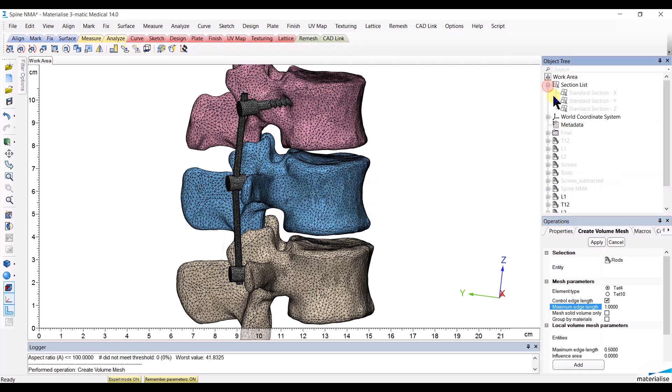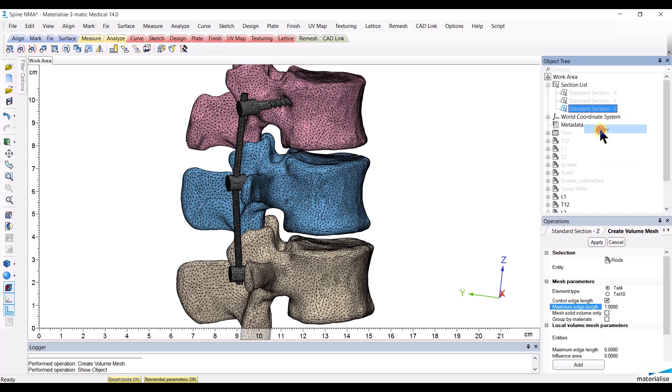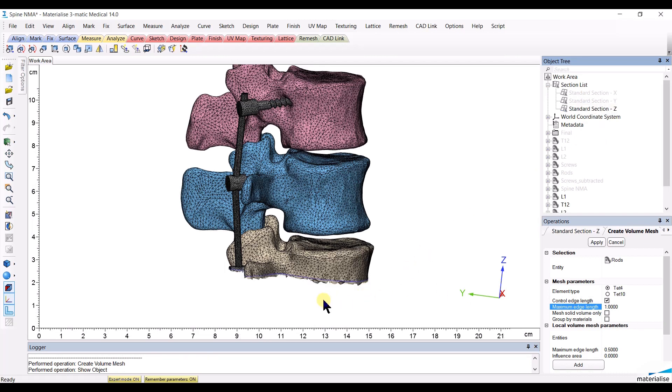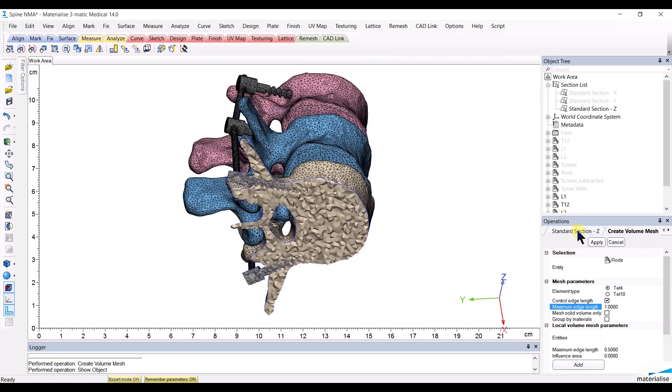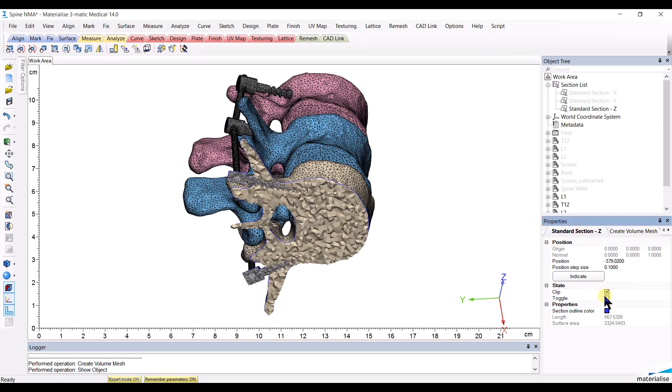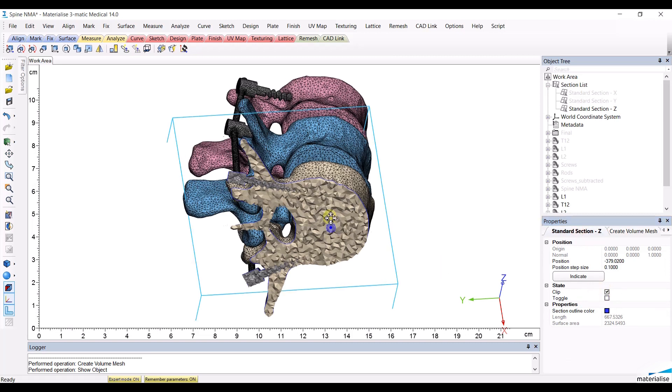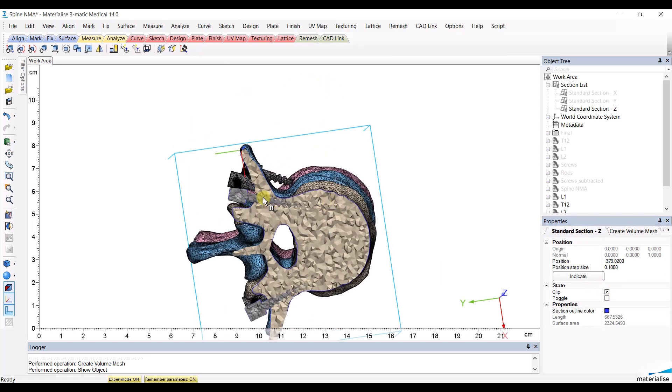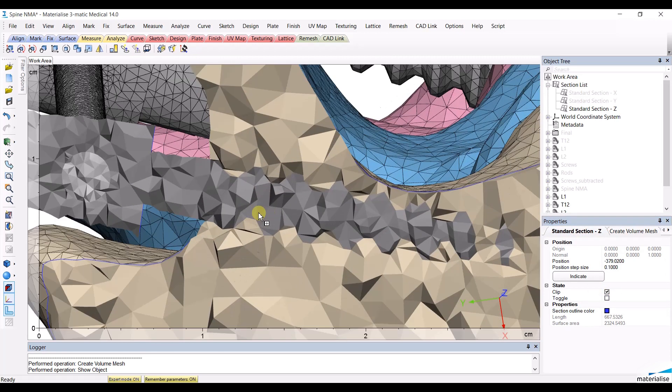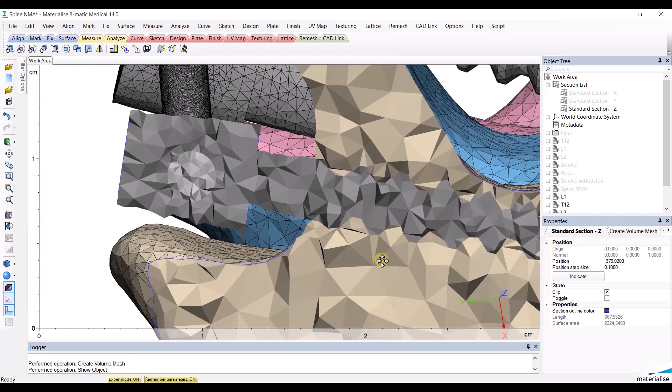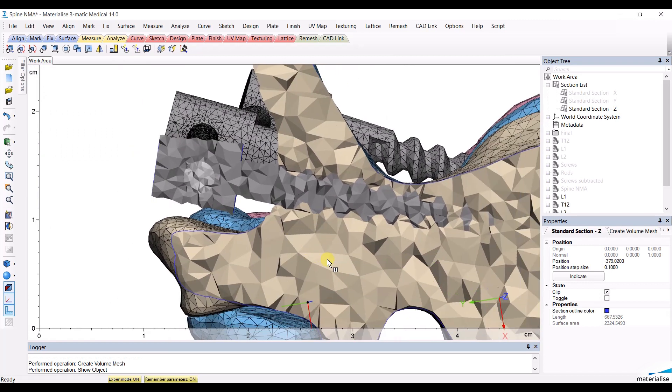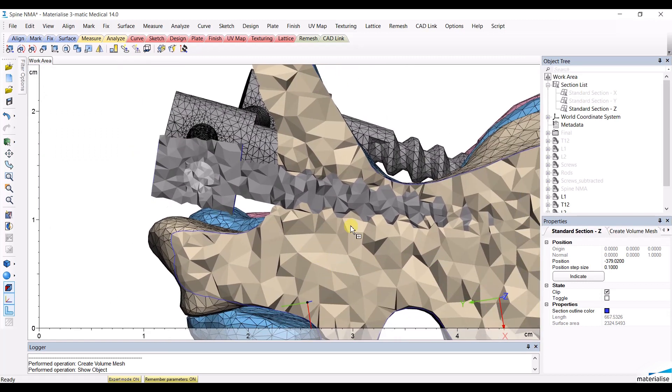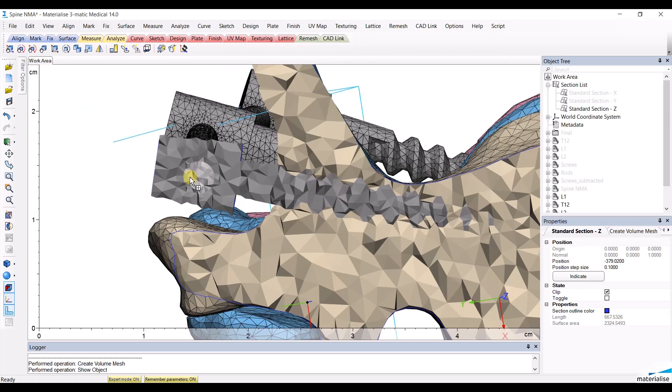You can observe the result if you show one of the standard sections and that you clip in the properties so that you can see the created volume meshes. And what you see here is that you have a volume mesh of a bigger size on the vertebrae, of a smaller size in the screws and of an even smaller size in the rods.